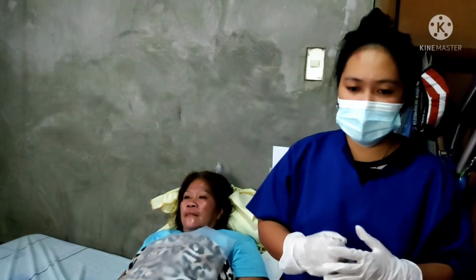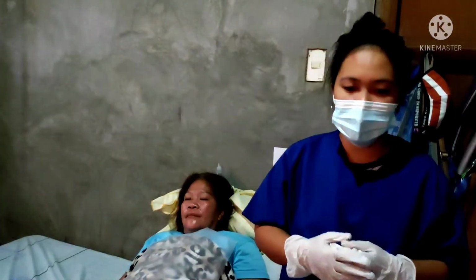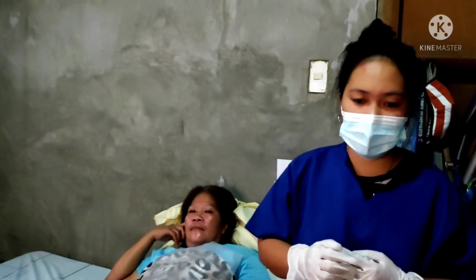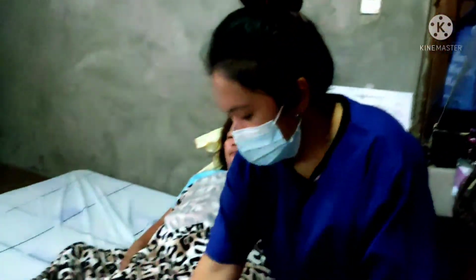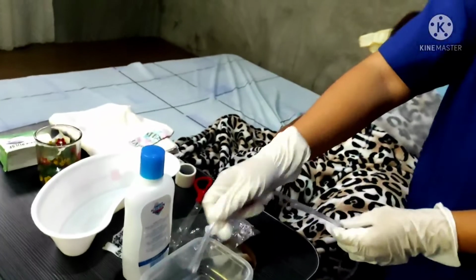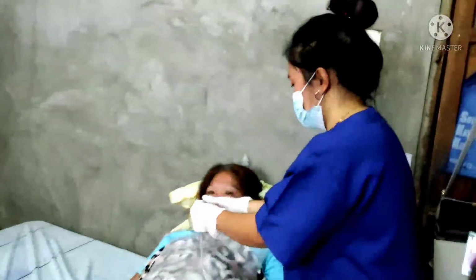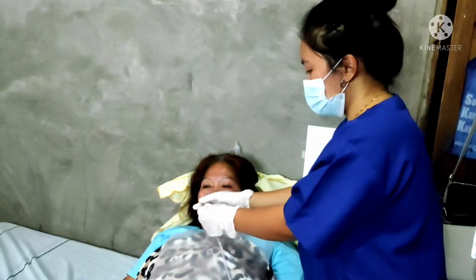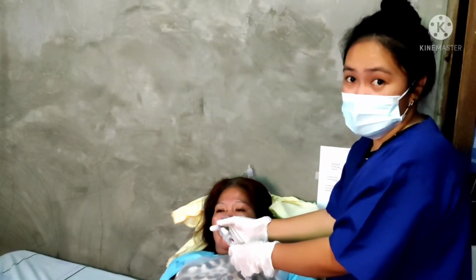Use your dominant thumb and forefinger to insert the catheter gently but quickly into one of her nares as she inhales. So let's assume that we insert the catheter into her nose.